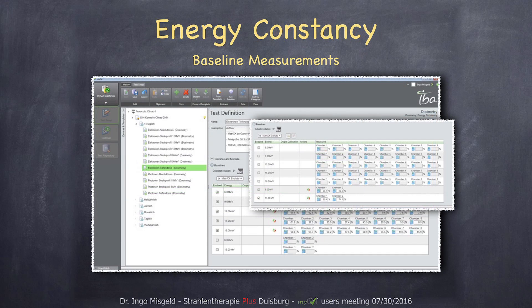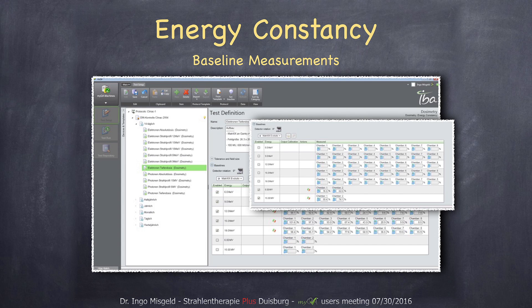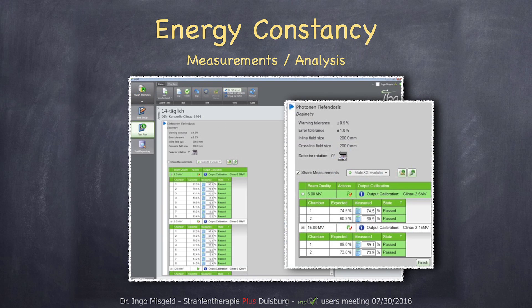Once that is done you can move on to baseline measurements. For the energy constancy you first have to define your test and then do the baseline measurement. You can choose the proper energies — in our case we have five electron energies and two photon energies. Once done, you can go to the normal measurements.